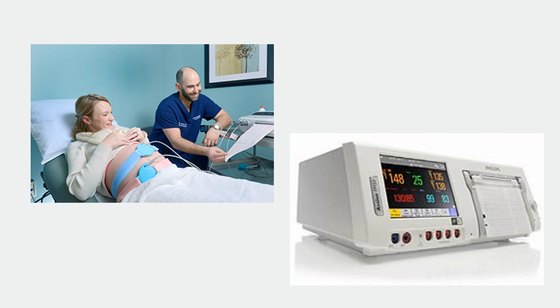And even though we utilize fetal monitoring on a continuous basis, it did not decrease the risk of cerebral palsy, but it did increase the risk of cesarean births. So it kind of has a good component, but then a not so good component in that it increased the risk of cesareans. And the reason for this is that we tend to intervene too early when we interpret some of these strips. So we are going to go over fetal monitoring.